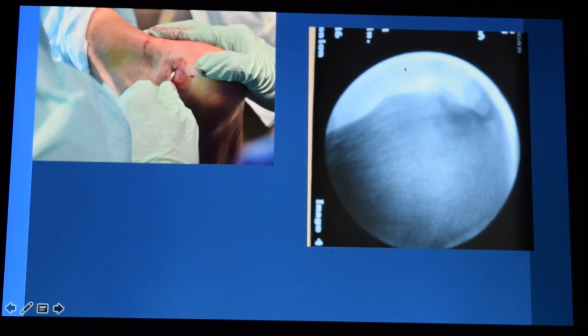So basically what we're going to do, we're going to go underneath the tendon and make our incision and begin to remove what amounts to not the retrocalcaneal spur, but the Haglund's deformity first. You can see the retrocalcaneal spurring is right here. You don't want to go too far down, you'll disrupt your insertion. So you're going to go across here and about like that.